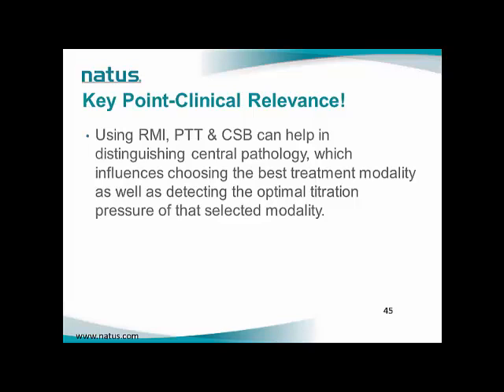Using RMI, PTT, and CSB can help in distinguishing central pathology, which influences choosing the best treatment modality, as well as detecting the optimal titration pressure of that selected modality.